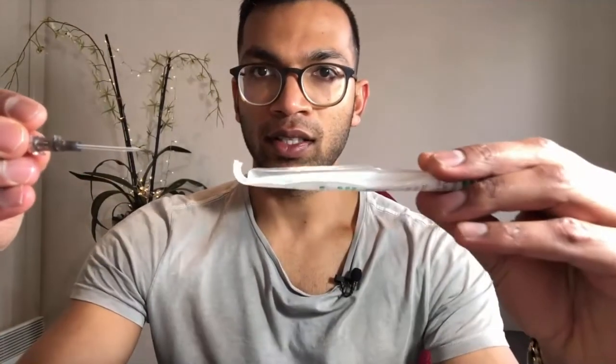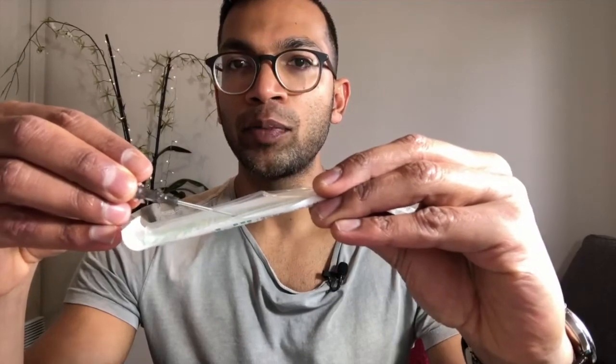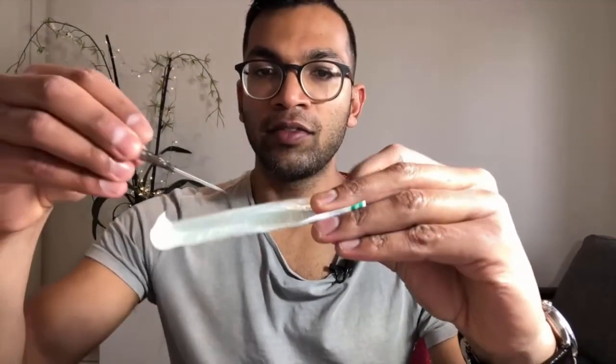Now, this is a 16 gauge cannula. As you can see, it's very good at cutting into a vein. Obviously, the cannula has a very sharp tip. I'm just going to demonstrate with this over here that you can easily cut through, and it's very good at cutting through, which means, sadly, that it's also very good at cutting through the other side of whatever you're going through. So imagine that this packet that it came in is the vein. It's very good at accessing the vein, but very good at going through the other side.